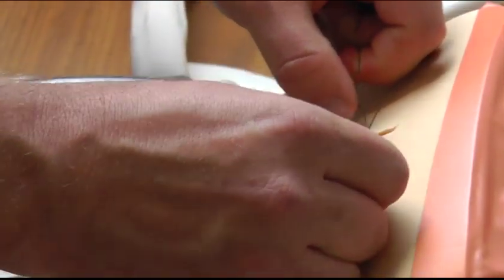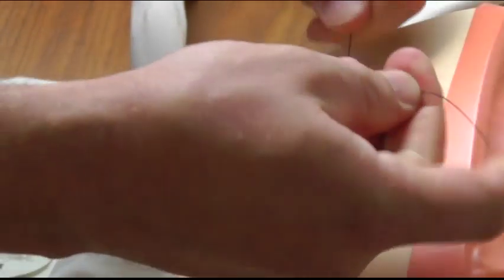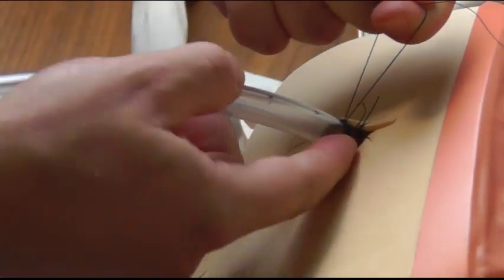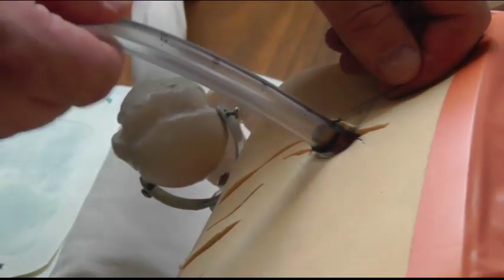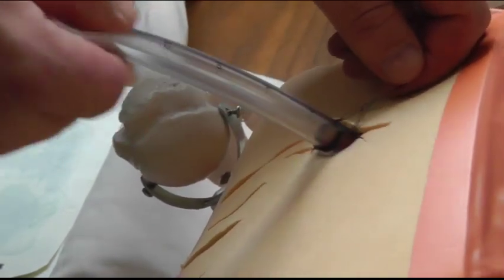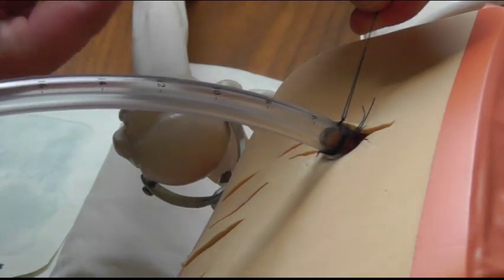Make sure it's slid right down fairly close to the skin so you can see that you're not coming out along the tube. There, nice short ends. There's very little room for it to move in and out. You can see that tube. The skin will move, but the tube itself isn't going in and out of the skin. You then cut your ends off.